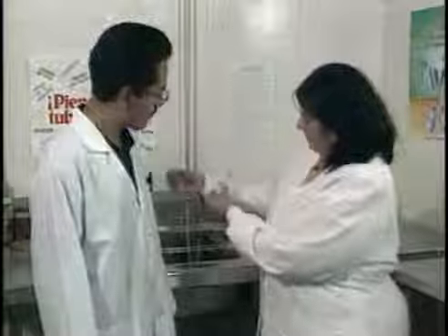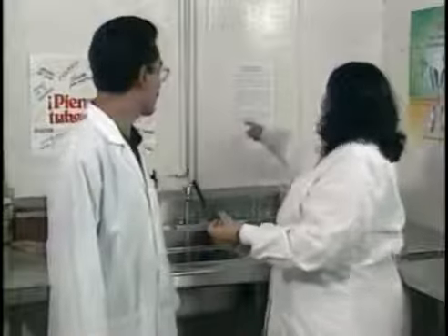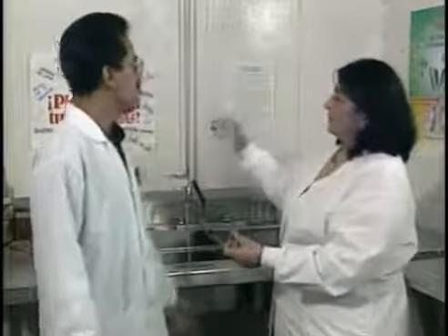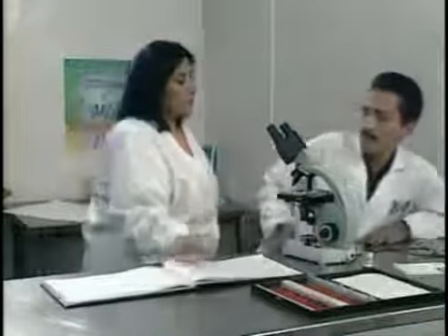If the negative control appears red after the staining procedure, this is the result of incomplete decolorization. If the positive control slide does not show AFB, either the staining reagents are defective or the procedure has been performed incorrectly. When the problem has been identified and corrected, repeat the staining procedure with new slides and controls.